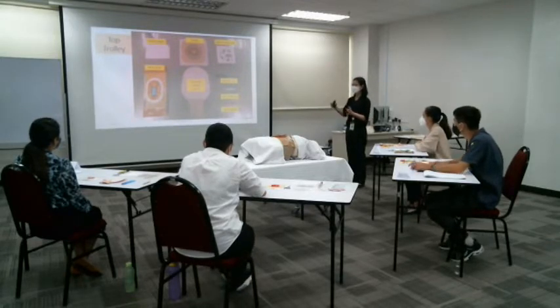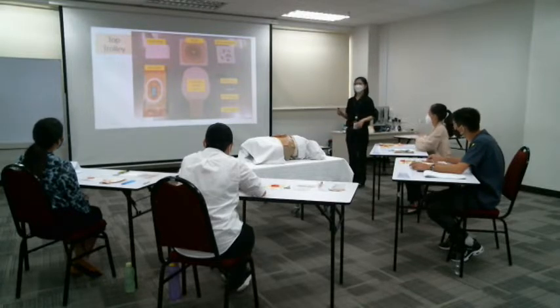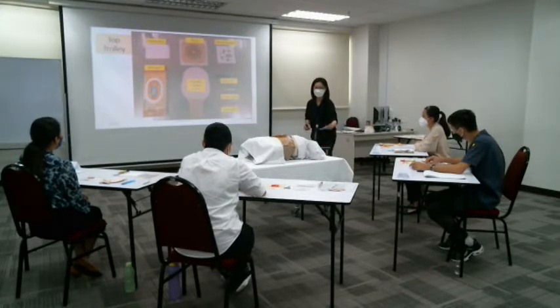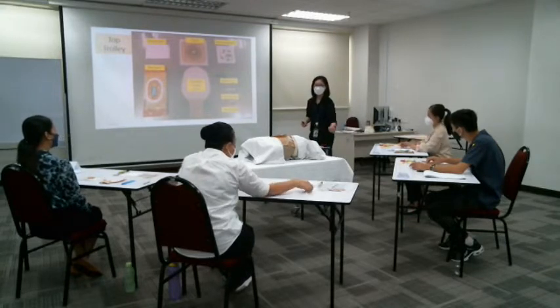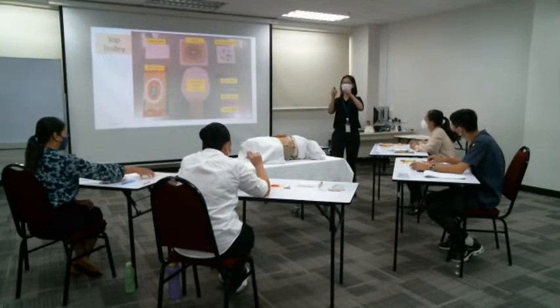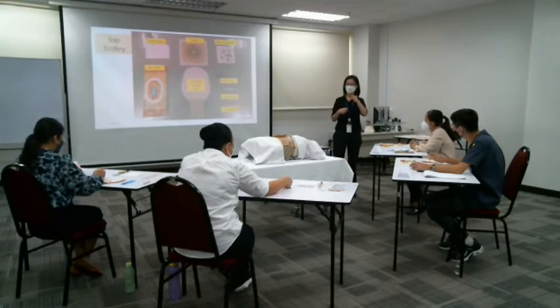You take the one-piece appliance. Measuring guide, right? So there are two ways you can measure the size of the colostomy. So this is the measuring guide that helps you to measure the size of the stoma. Or otherwise, what you are going to do later on is using the plastic clip, okay, and measure and do the cutting.